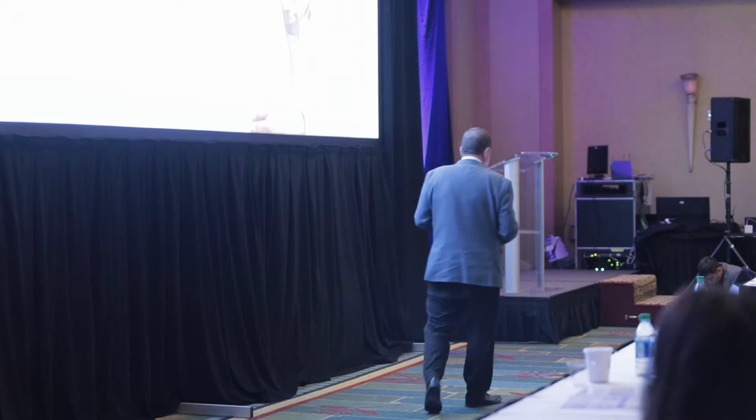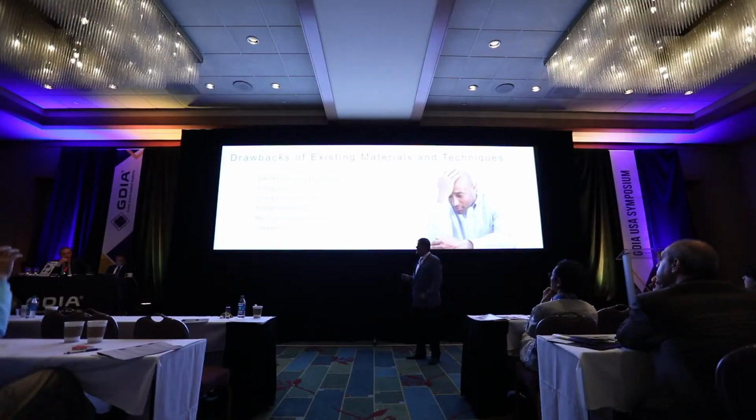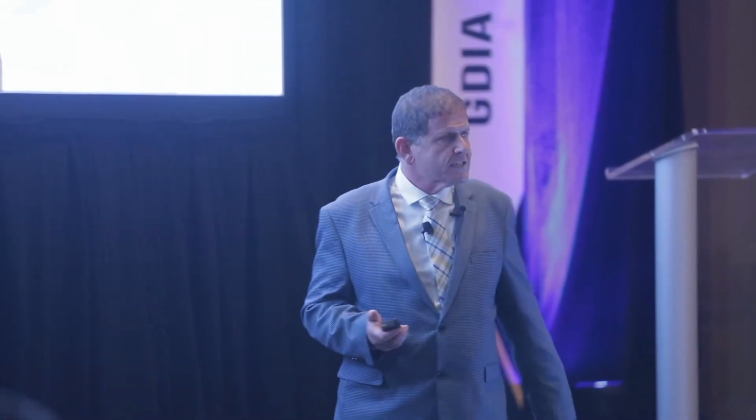So let me summarize the existing drawbacks of the grafts that we have today. And please, if somebody thinks that I'm wrong, raise your hand. They are difficult to stabilize and to work with. Therefore, they prolong our chair time. In the end, we have a limited amount of vital bone. Therefore, it prolongs the healing period. Membrane coverage is essential. Therefore, it increases our costs.